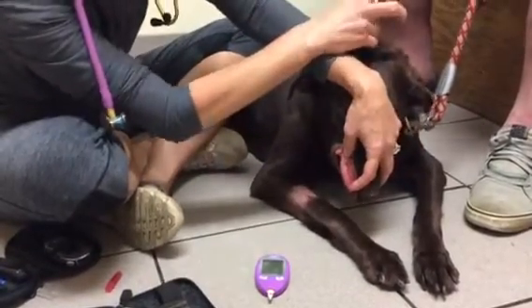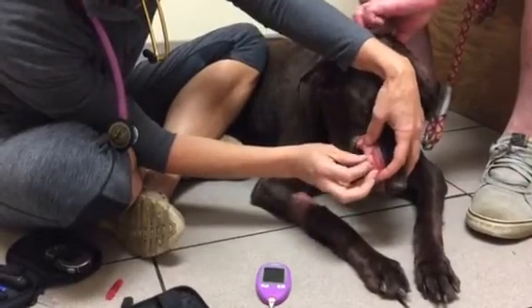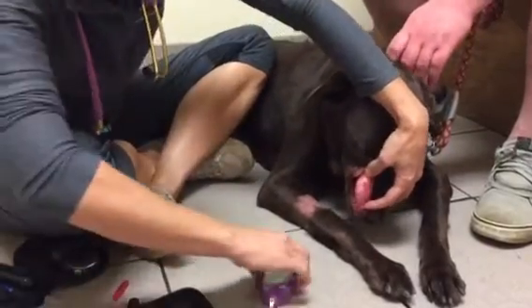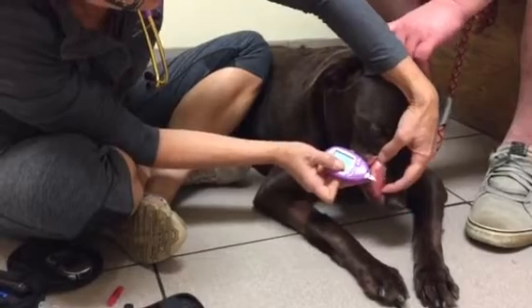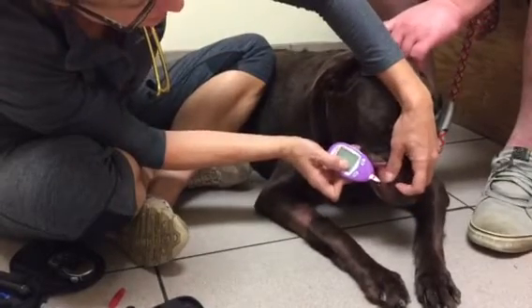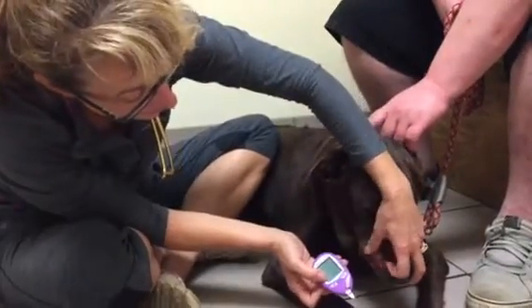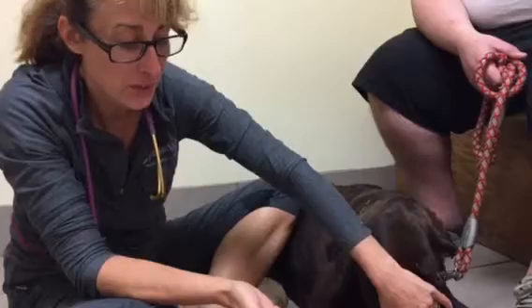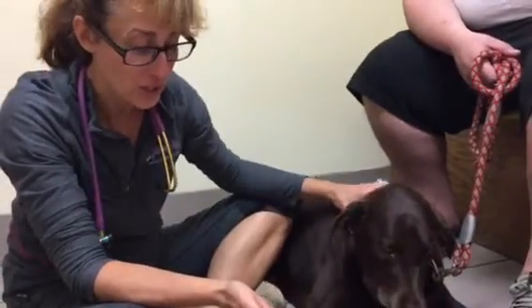So I'm just going to have you rub her head for a minute — give her a good rub — and then we just need to get a little drop of blood. That's a very small gauge needle to get a tiny drop of blood. Here's a drop of blood, and then you just have to touch it to the edge of the glucometer until it beeps and then you've got enough. I put a little pressure. So she's 293 — that gives us an indication of what her blood sugar is.